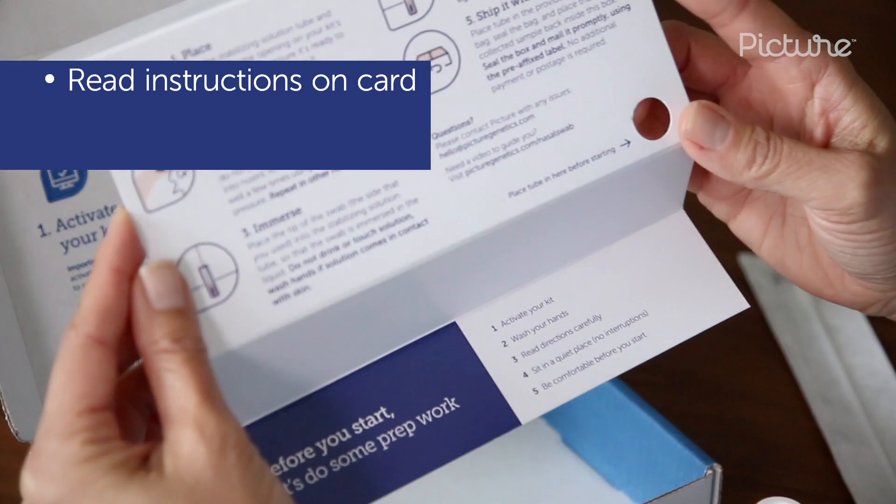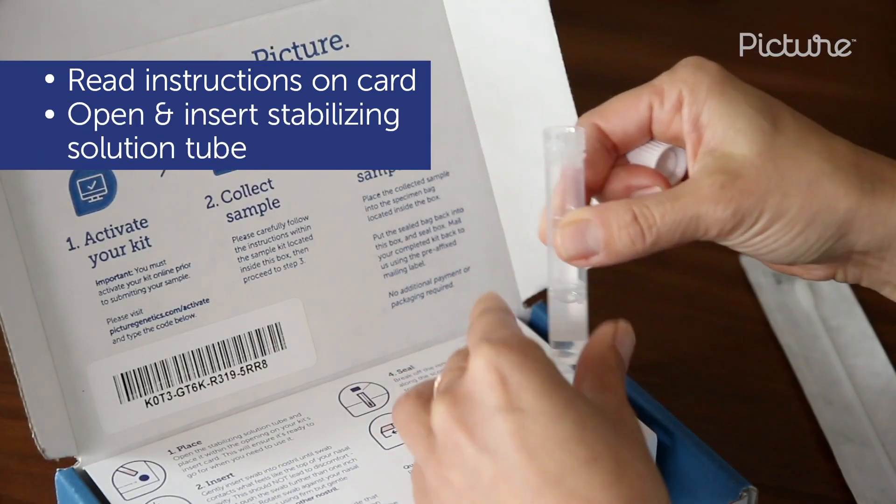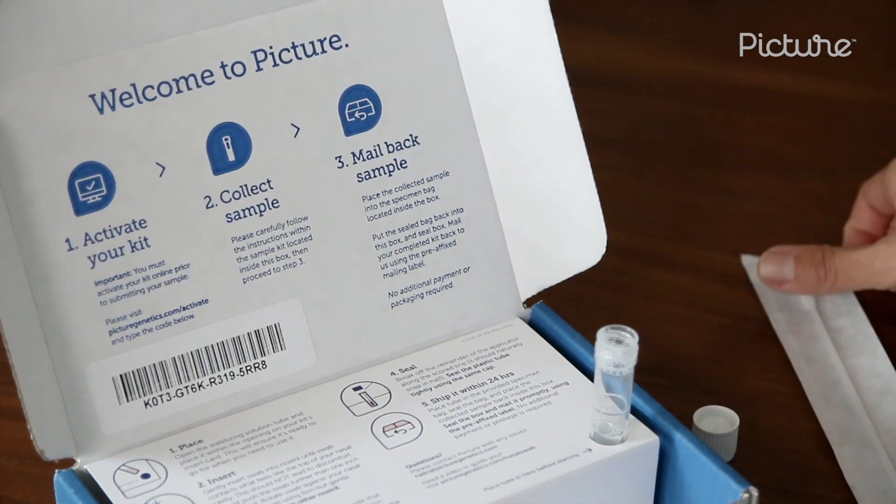After reading the instruction card, open the stabilizing solution tube and place it in the opening on your kit's insert card, ready to receive your sample. Be careful not to touch the solution.